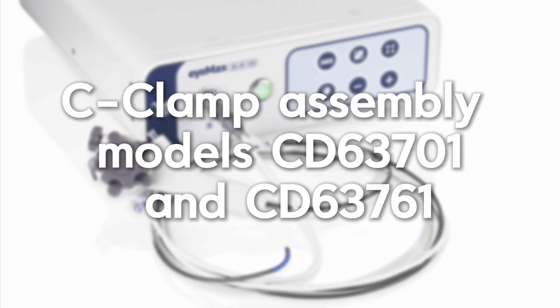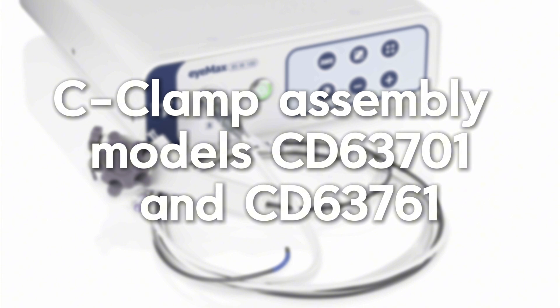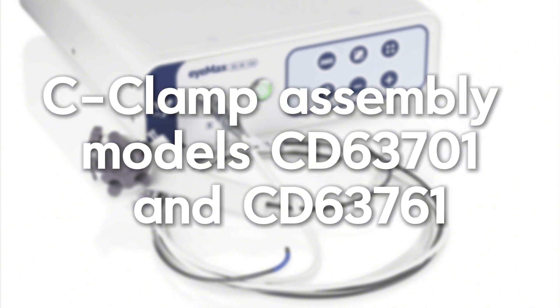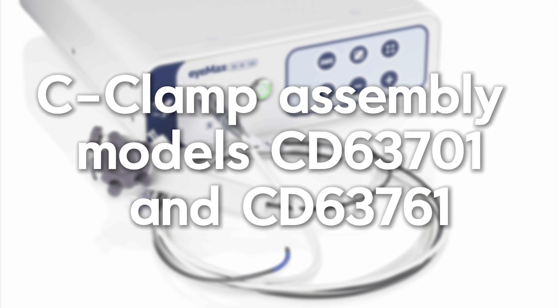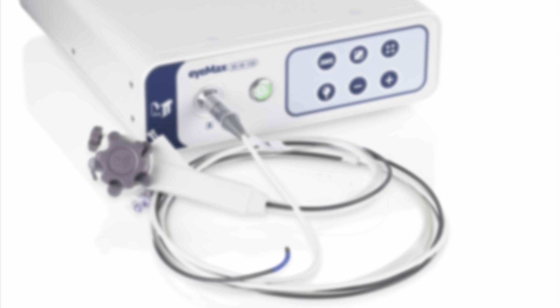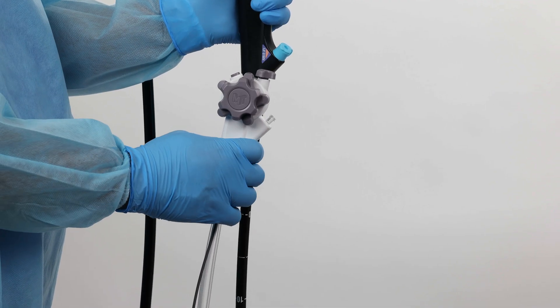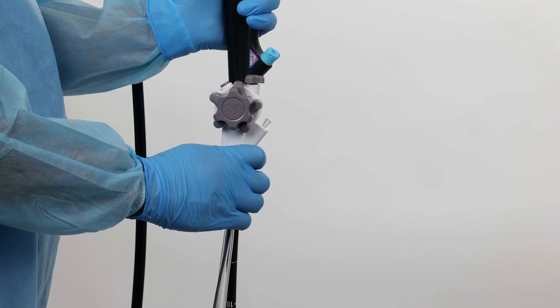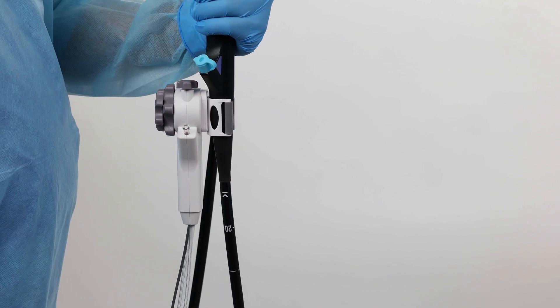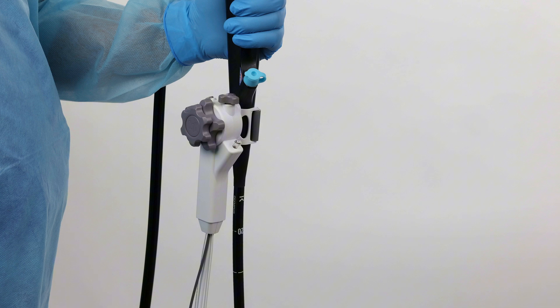When the IMAX scope is equipped with a C-clamp assembly, such as models CD63701 and CD63761, it can be attached to the duodenoscope using the C-clamp. Place the clamp part of the IMAX scope onto the boot of the duodenoscope. Clip the scope onto the handle of the duodenoscope and ensure that it is secure.